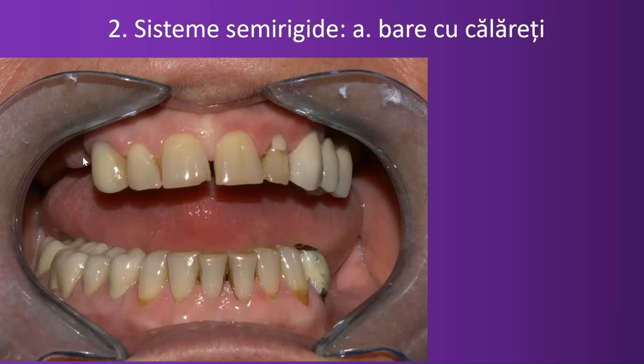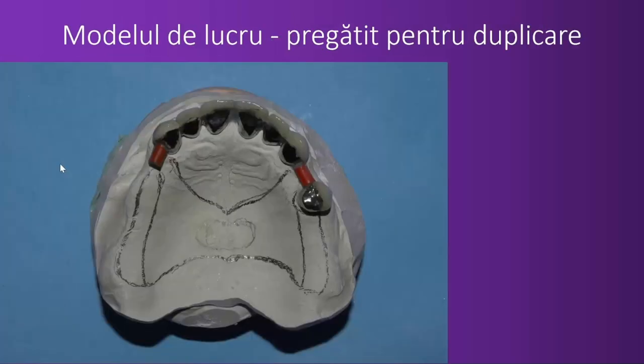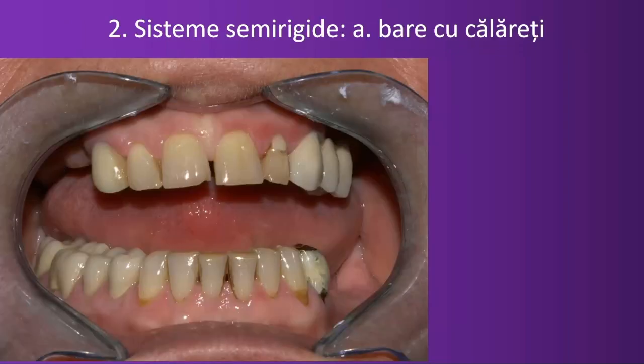Now, when I'm talking to you, the patient already has implants, but a long time ago, like 12 years ago, she believed that she was sick with an illness that prevents her from receiving implants. So she said, okay, let's try to do a removable denture. So the solution, just imagine, I won't let those teeth look like that, right?